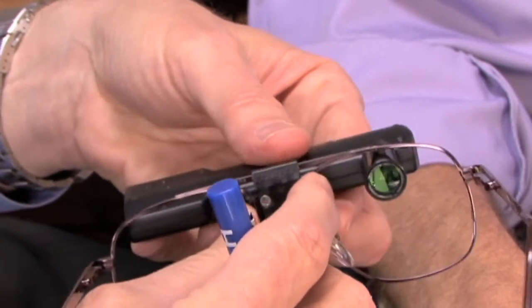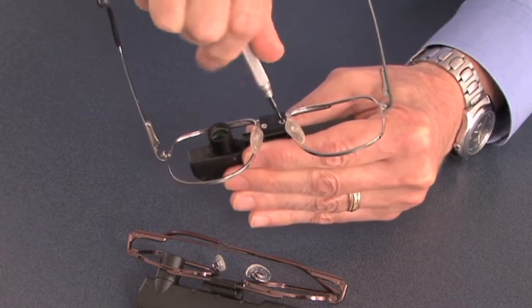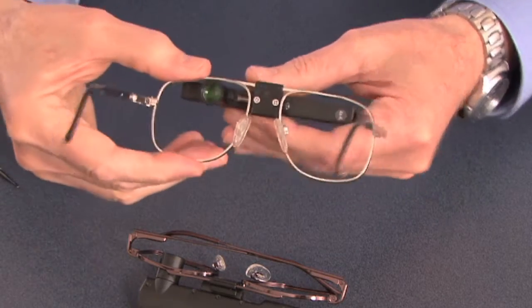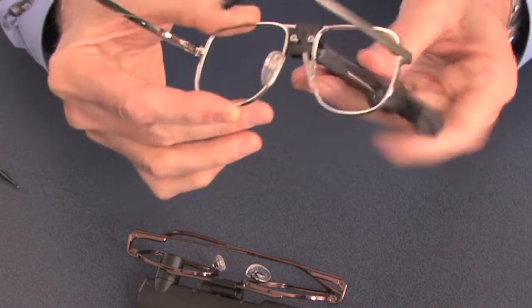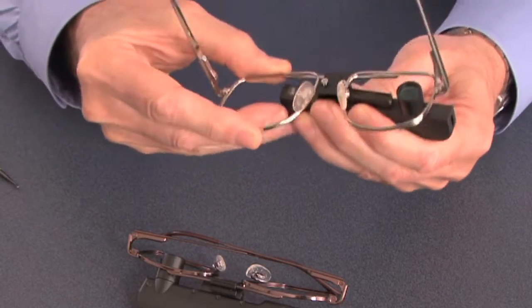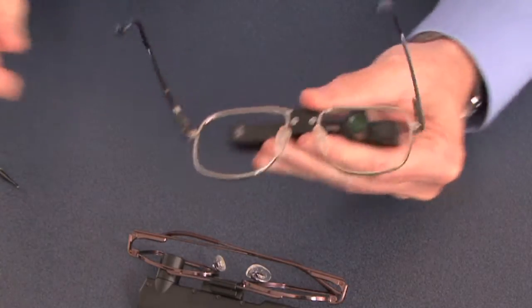Now you can slide it right to left, change the angle, but it stays where you put it. By loosening it completely, you can slide the telescope off the bridge, return it around the other way, replace it on the frame, and now it's positioned for the other eye.